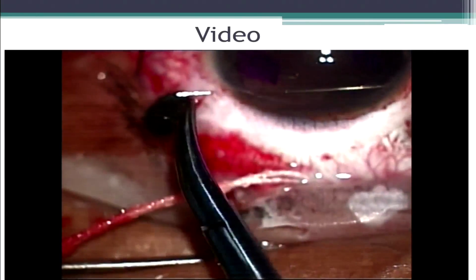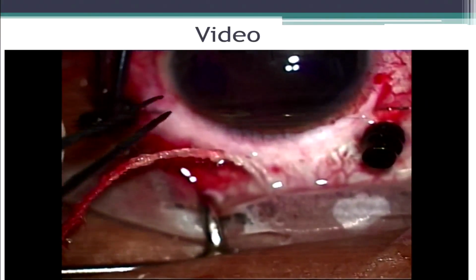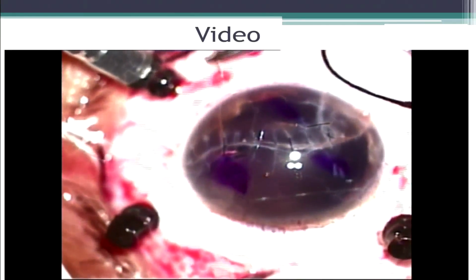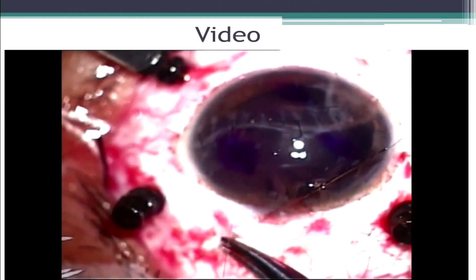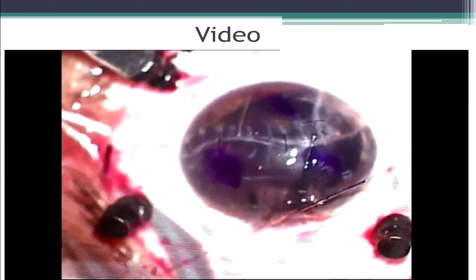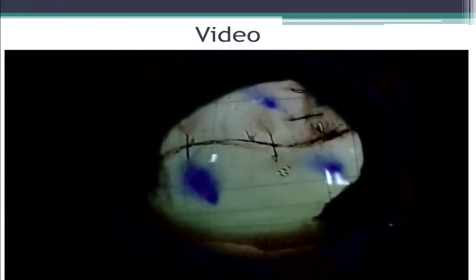Like this, we create 3 sutures superiorly, 2 inferiorly, and a grid of 2 sutures on each side. So we create a Prolene mesh and we tie this suture on the sclera. What you can see, we are creating a vertical grid. And then it is sutured on the sclera. If we see on retroillumination, you can see 3 sutures here, 2 sutures here, and 2 sutures on the side.